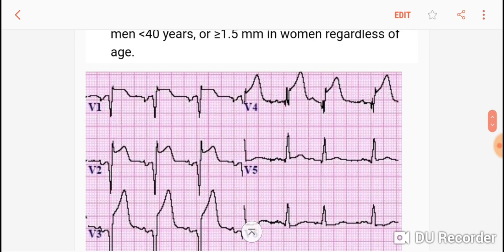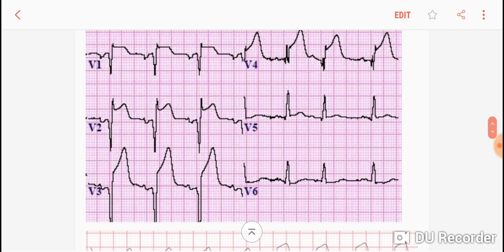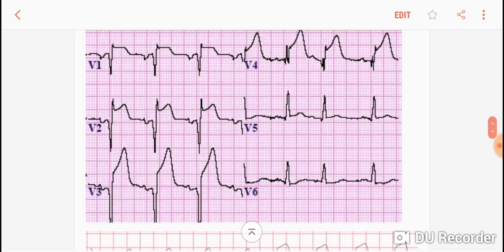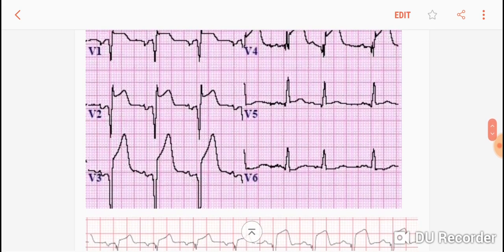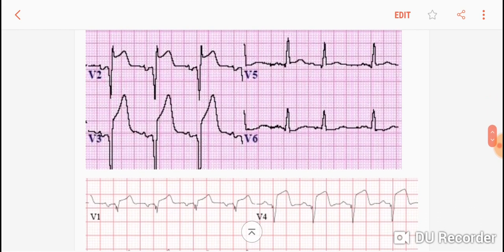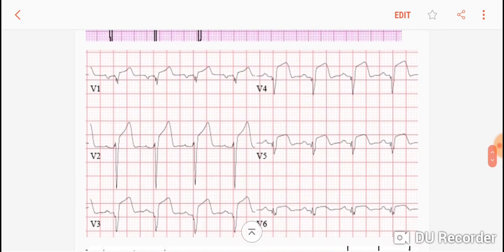In this example, you can see ST segment elevation where the J point is above the baseline in V1, V2, V3, and V4. So it is an anterior wall STEMI. It is more than 2.5 mm in men — so easily, for a man over 40, this meets criteria for a STEMI.